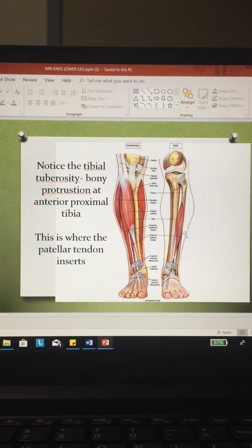So where is the pain? Is it distal? Is it proximal? If you're looking at the gastroc muscle, because that is going to be more of that upper calf, I'm going to make sure I get that knee joint on, and as much of that lower leg as you can, right?